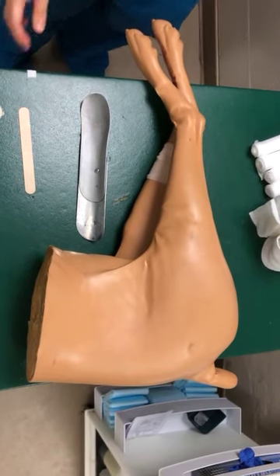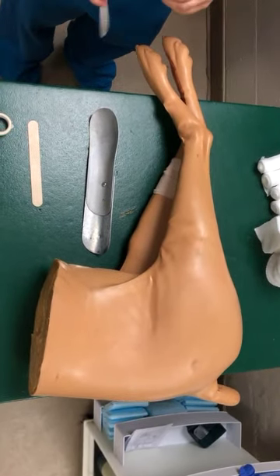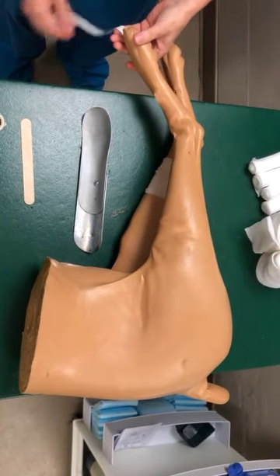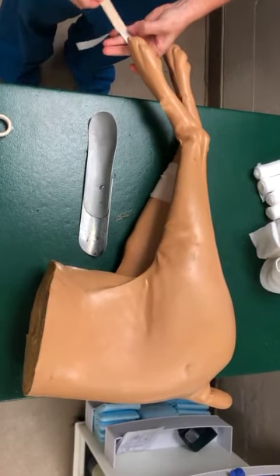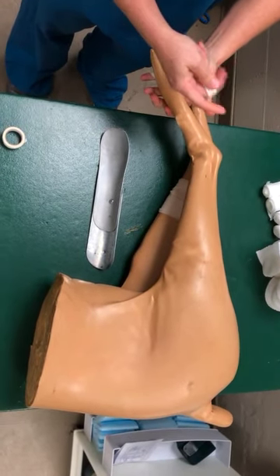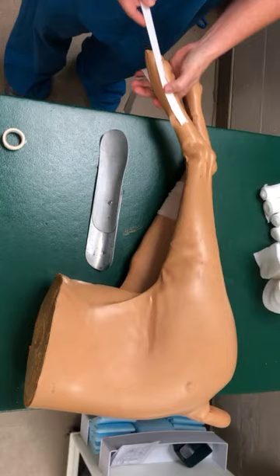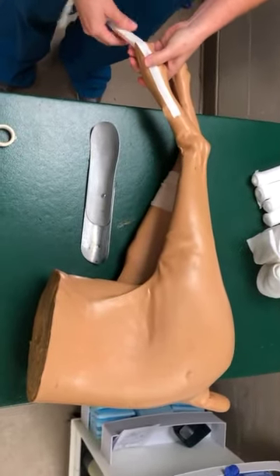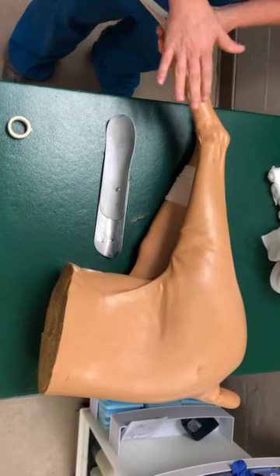Metatarsal fractures — showing a soft padded bandage with a caudal splint. Stirrups will be placed medial and lateral. Use a tongue depressor in between to make your life easier. If you have wounds, please do not put your stirrups in the wounds. Do not put your stirrups over the patient's pad either. They need to be on the skin.